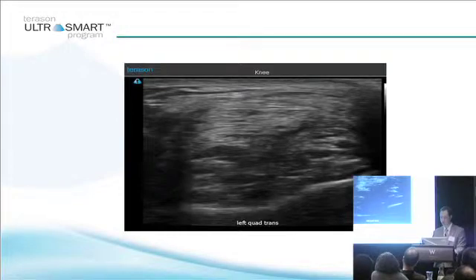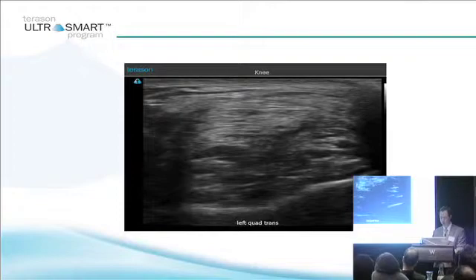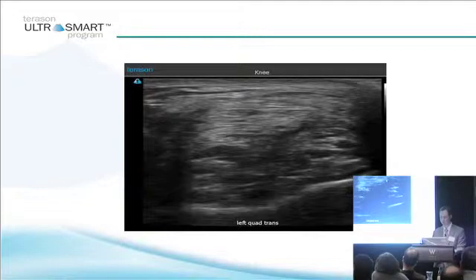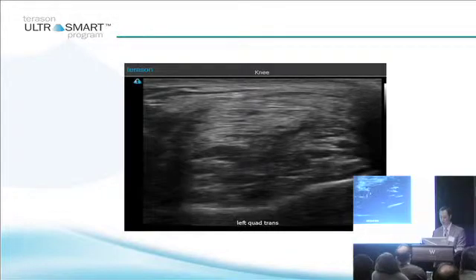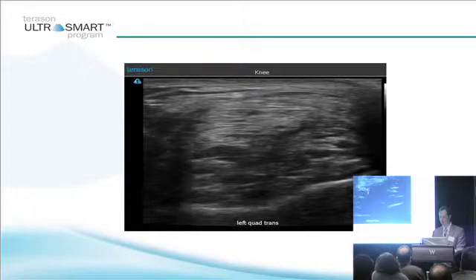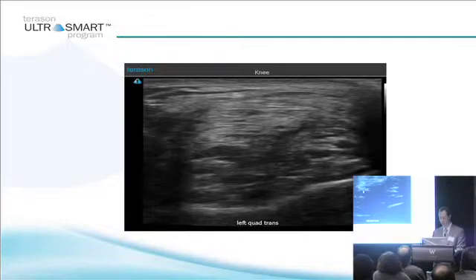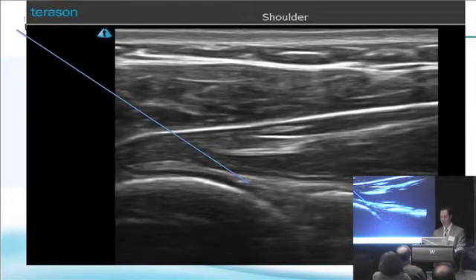If I go in transverse, here we're looking at one, two, three tendons of the quadriceps. This whole thing is the quad right here, and the quadriceps has a trilaminar appearance. Just underneath it is that little tiny bit of fluid right here. So it's in that transverse view of the quadriceps that you'll be able to pick up that suprapatellar recess, just above the patella. And it's in that view that you can achieve an injection into that area.